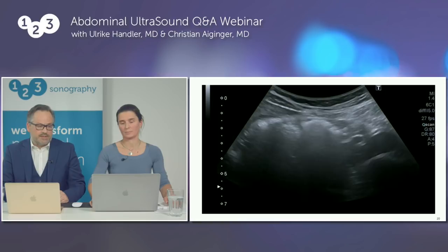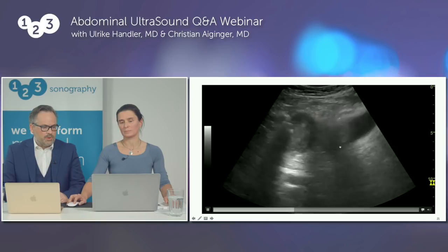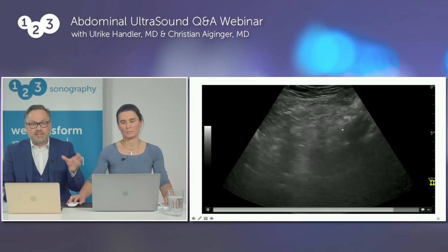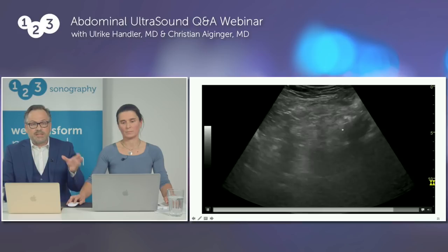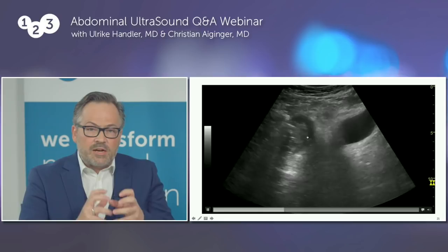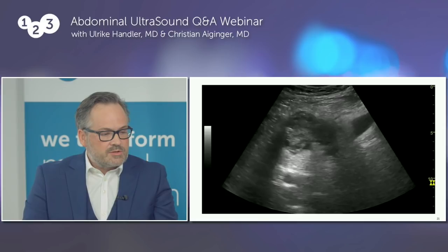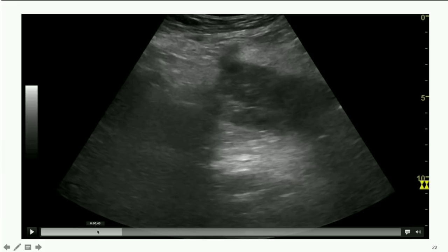In comparison, here there is a quite hypoechoic thickening of the wall; we can detect the anterior and dorsal wall because the thickening is so great that the lumen is narrowing and there is nearly no gas between the layers. The gas-filled portion stops at this point where there is a hypoechoic tumor — in this case a colon carcinoma blocking the bowel and causing intestinal obstruction.